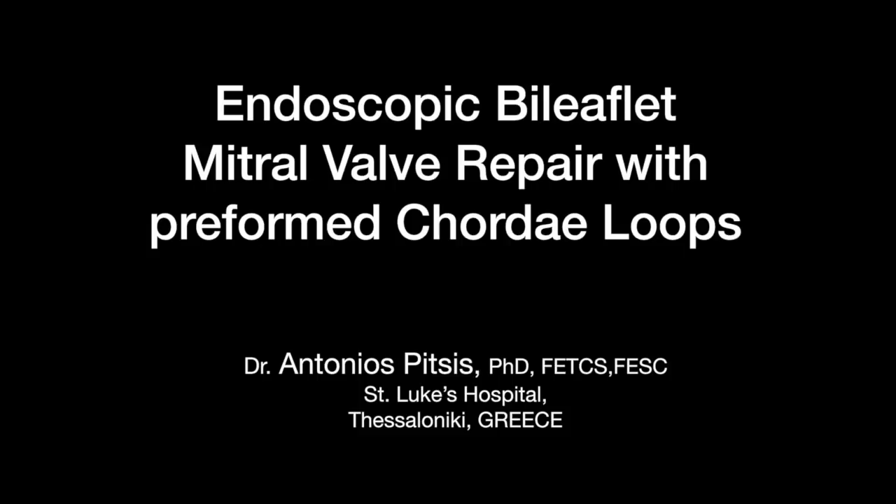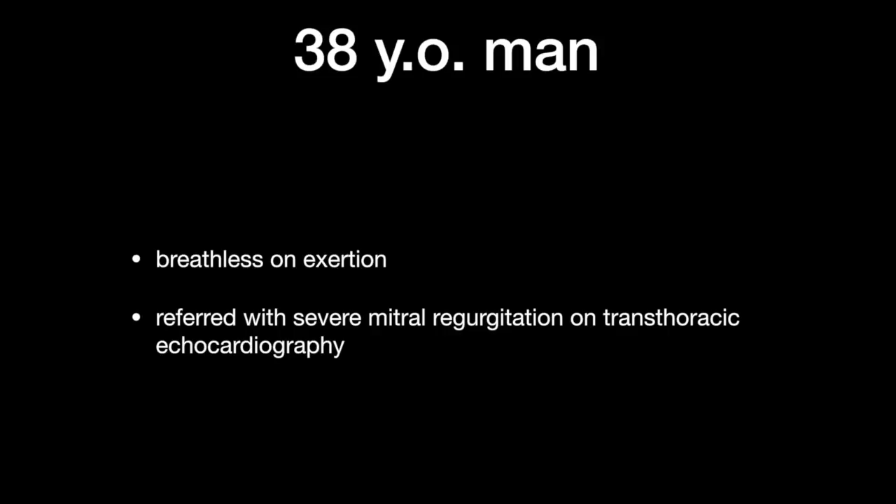The following is an endoscopic bi-leaflet mitral valve repair with pre-formed chordal loops performed by Dr. Antonios Pitsis of St. Luke's Hospital of Thessaloniki, Greece.